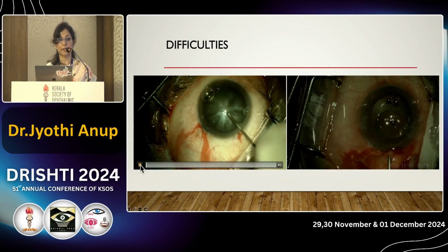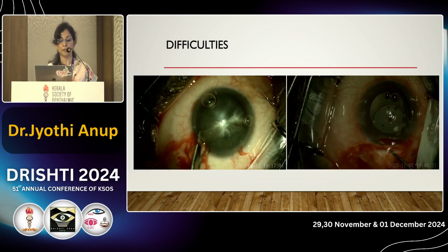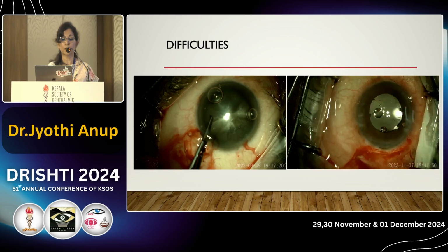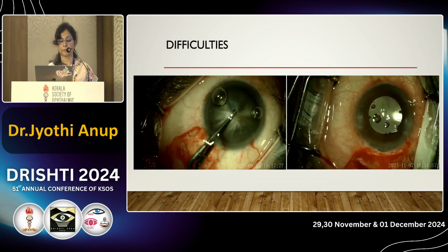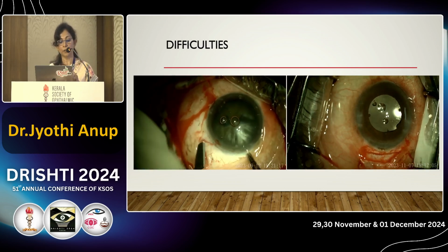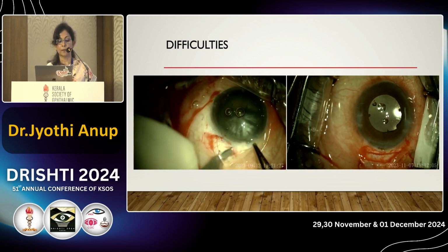Or in the other way, when you experience any unexpected problem in phaco, as you can see a large rhexis tear known as the Argentinian flag sign, don't hesitate to convert. Here it was a clear corneal temporal tunnel. Now going for a superior tunnel with a frown incision, and the surgery is completed.